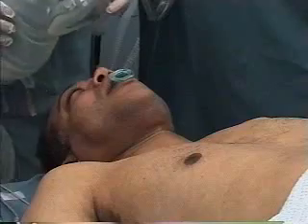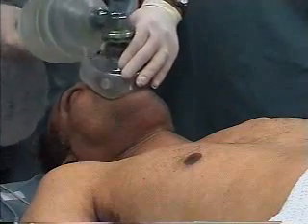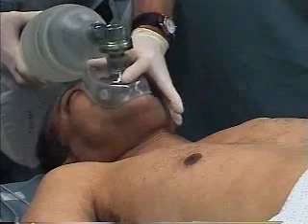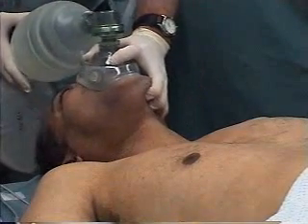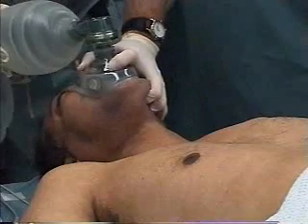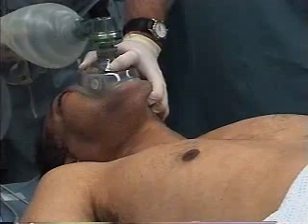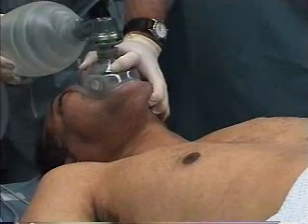reflex. Now try positive pressure ventilation with bag and mask. Place the mask over the patient's nose and mouth, with your thumb over the patient's nose and your forefinger below the mask's ventilation port. Lift the jaw with your other 3 fingers. Squeeze the bag and observe for chest movement and misting in the mask.